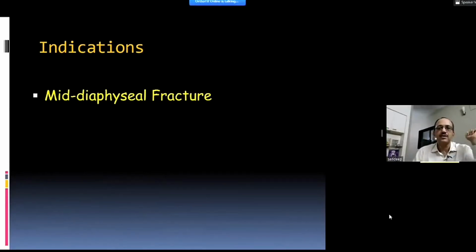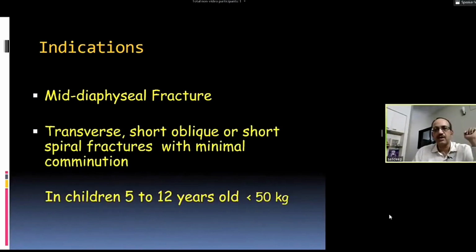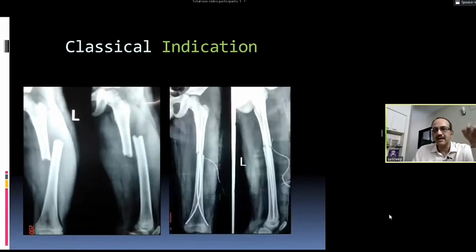Okay. So it's a mid-diaphyseal fracture, which is transverse, short oblique, or a short spiral with minimal comminution. And the ideal indication is between a 5 to 12-year-old child who does not weigh more than 50 kilograms. Because more than 50 kilograms, the elastic nailing system has been found to be a little mechanically unstable and can cause bending or deformation. The classical indications are, as I said, transverse fractures in the middle third between 5 and 12 years, which can be nailed thus without any plaster support.